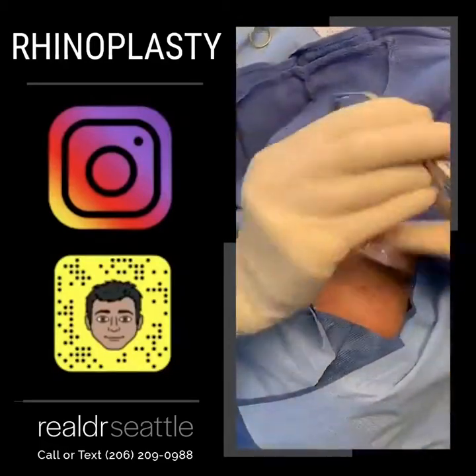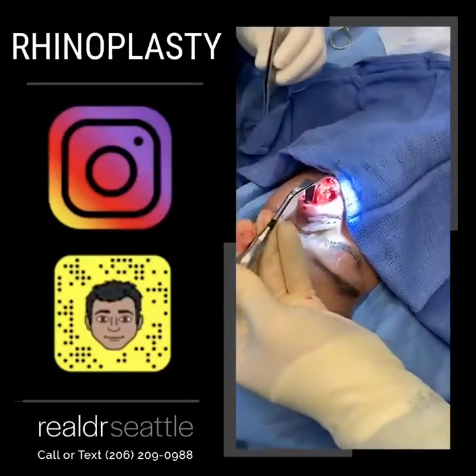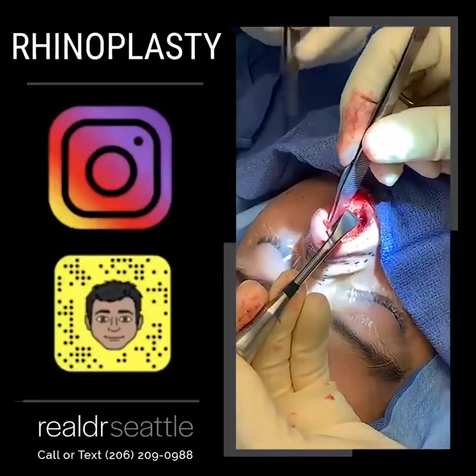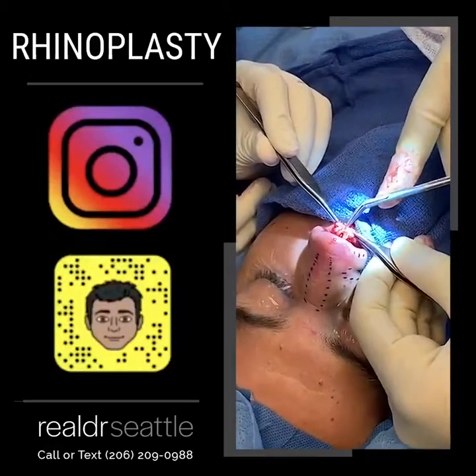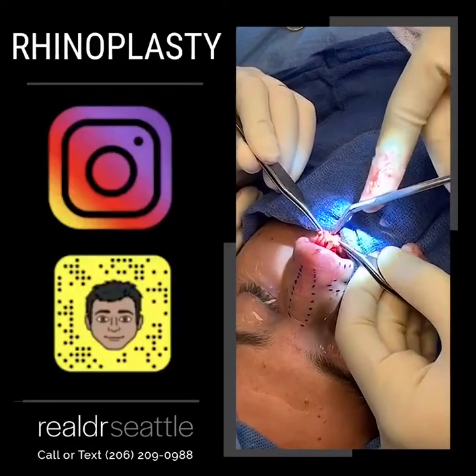We have the cartilages exposed, and now we're going to be dividing the cartilages to find the septum. We can see the entire nose is open right now. These are the lower lateral cartilages here. We're going to expose the upper lateral cartilages up here, and the septum in the back. Right now I'm dividing the interdomal ligaments to get to the septum, so I'm dividing the domes in half.